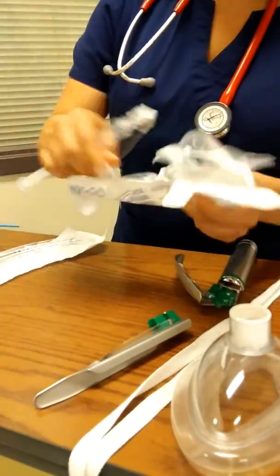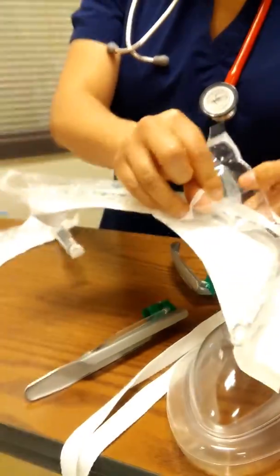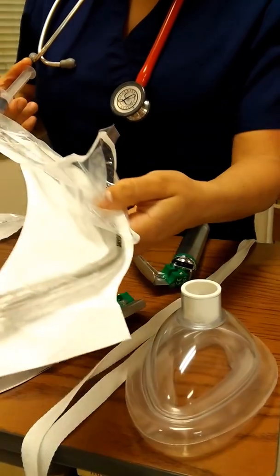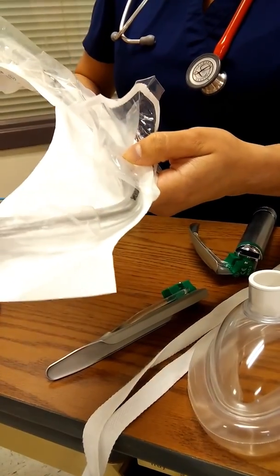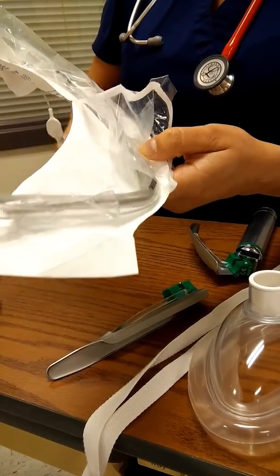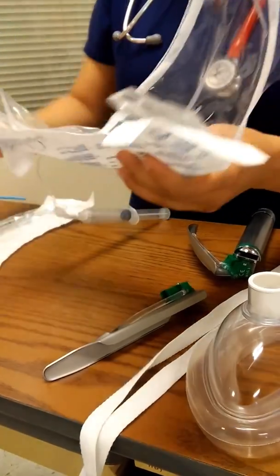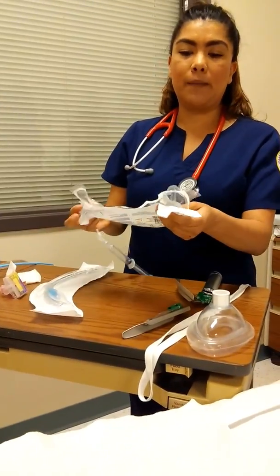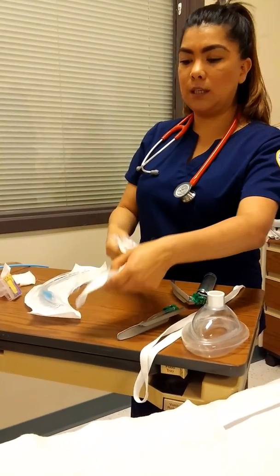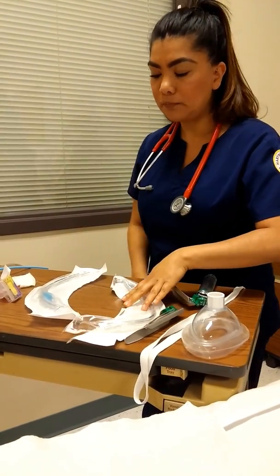So the way that we do it is we open it, and we inflate the cuff so we see it inflated. But when intubating the patient, we want to assure that it is completely deflated. We also want to have lubrication, so we can place it on the tube to help better guide the tube in inserting it.